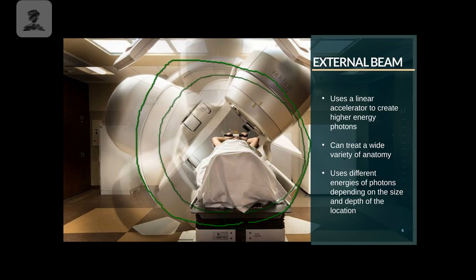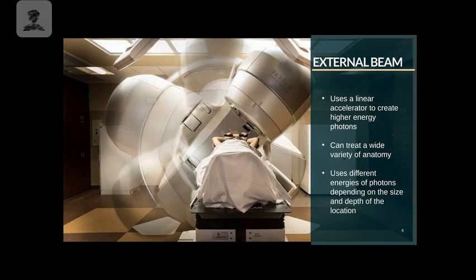But what's nice about these linear accelerators is that we can treat a wide variety of anatomy because it's so flexible. The table moves, the gantry moves. We can come in at multiple areas. And also, the gantry head is just very efficient and flexible. We can use a variety of energies to treat the cancer. So, if we need something to be a little bit more deeply penetrating, we alter our beam. If it needs to be more superficial, we alter our beam. There's just so many capabilities. And the only reason that we can do that is because we have this linear accelerator.